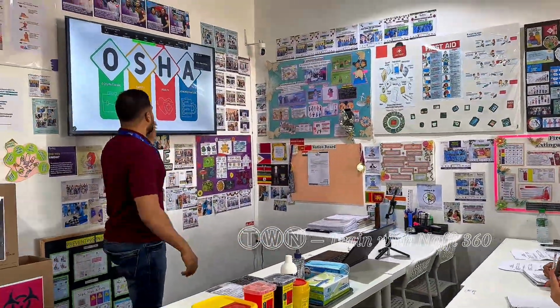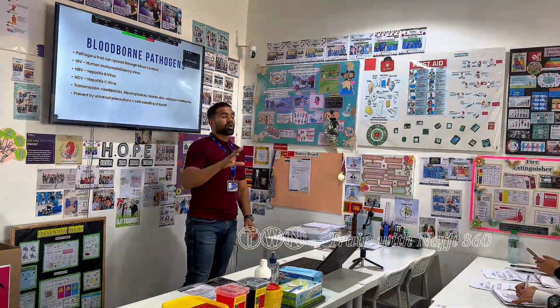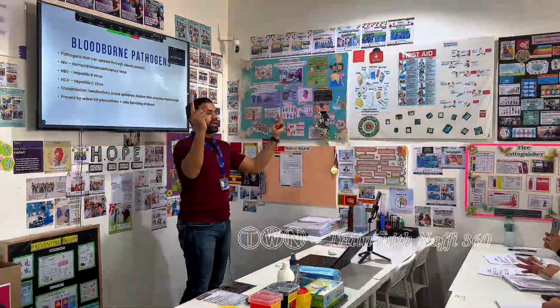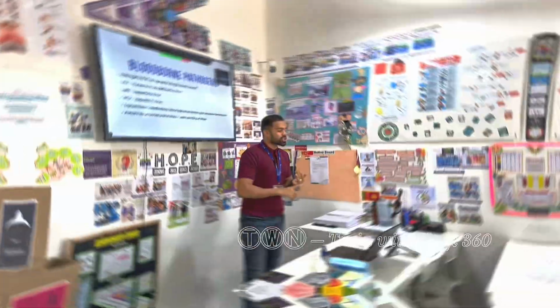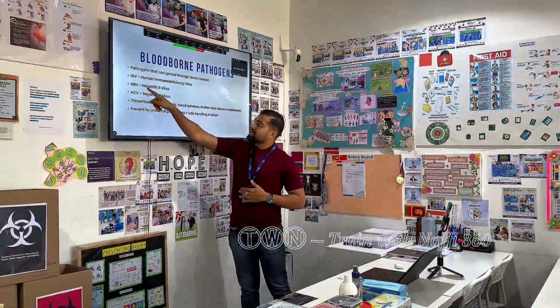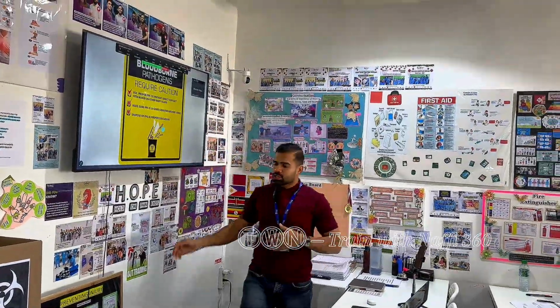Safe handling of sharp objects is another essential key point. Needles or any other sharps should not be recapped, bent or broken by hand. Sharps must be discarded immediately into the designated sharps containers. In addition to these precautions, we follow OSHA guidelines during training and clinical practice.